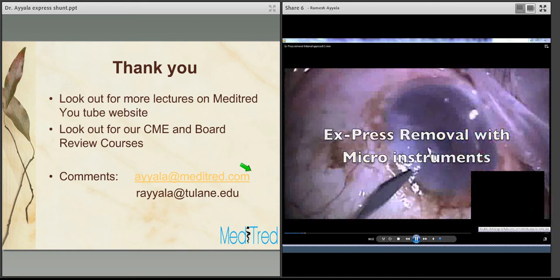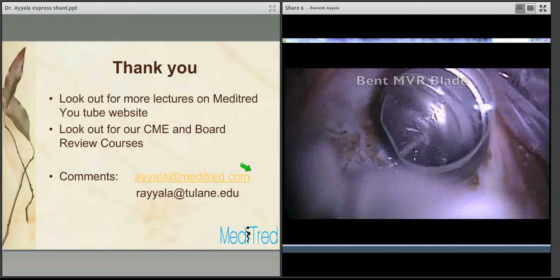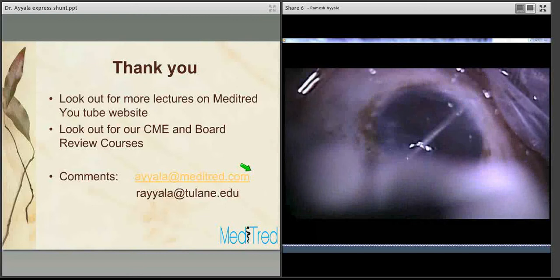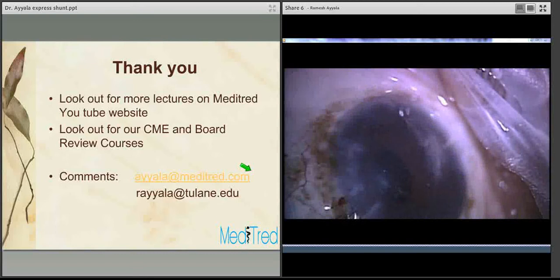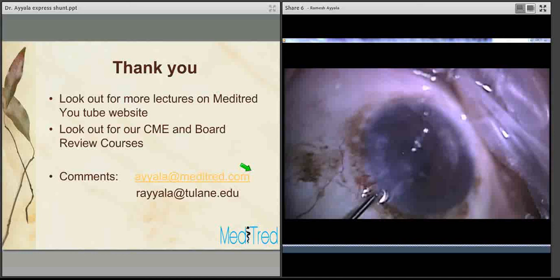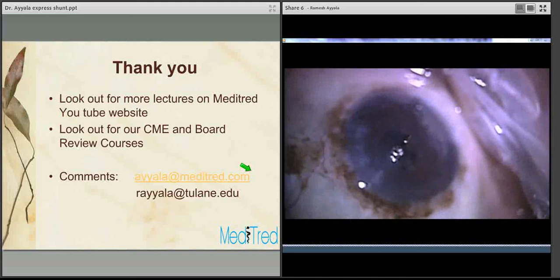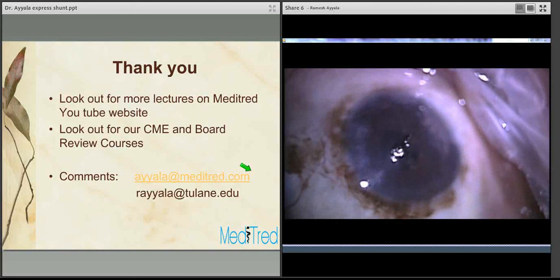In this video, I demonstrate how to remove the Express from within — the internal approach. Here is the MVR blade. Inject viscoelastic into the anterior chamber. Use the MVR blade to cut on either side of the Express Shunt to loosen the faceplate from within. Then go in with micro forceps and bring the Express into the anterior chamber — it is quite easy. Once done, enlarge the wound size to bring it out. The Express Shunt is an elegant, easy-to-use device that avoids resection of conjunctival tissue. That concludes our presentation on Express Shunt. Thank you very much.